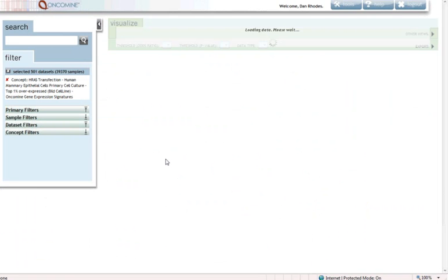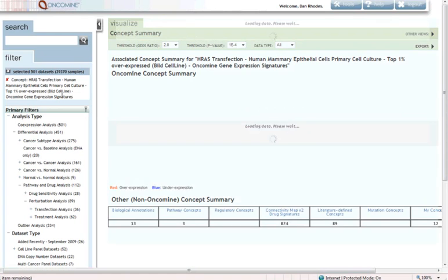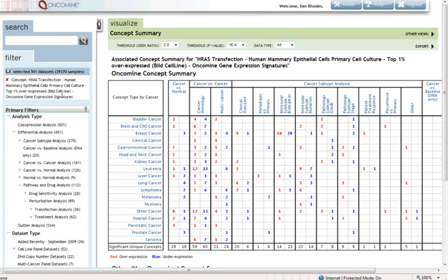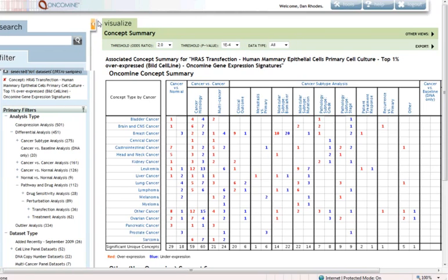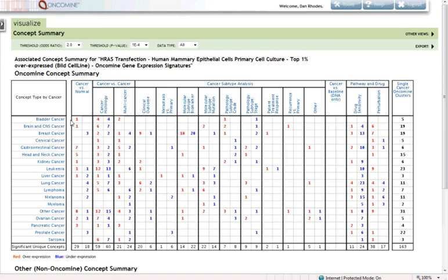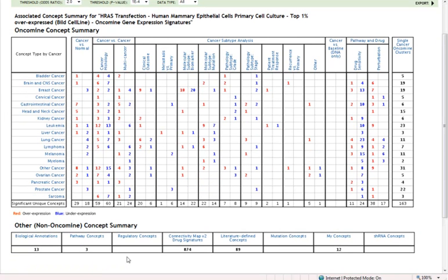So now we're jumping into a different analysis mode. Our query concept is this HRAS transfection signature, and we're asking the question, where in Oncomine do we see overexpression or coordinated expression of the HRAS transfection signature? We come to a summary map where we have cancer types and analysis types. Also down below the summary map, we have other types of associations for a signature.